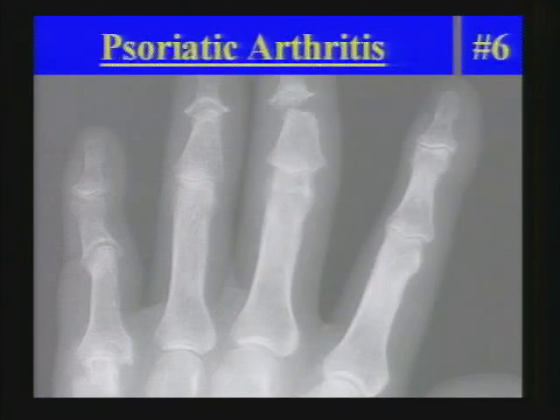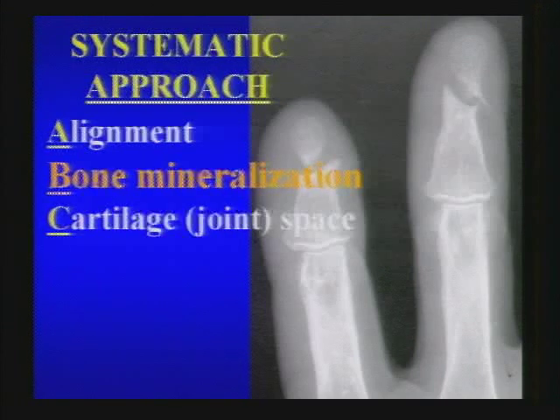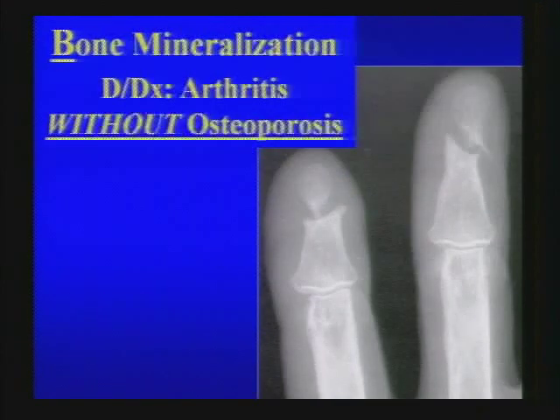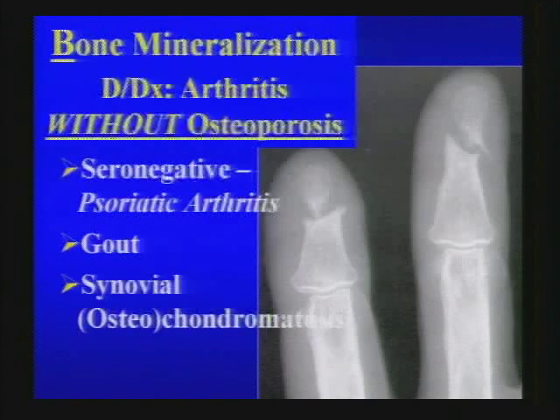Using the systematic approach: alignment, then bone mineralization. Here we don't have osteoporosis. When we have an abnormal joint with arthritis but no osteoporosis, the differential is relatively short. Seronegatives like psoriatic arthritis need to be considered. Gout, synovial osteochondromatosis, and PVNS also belong on that list.